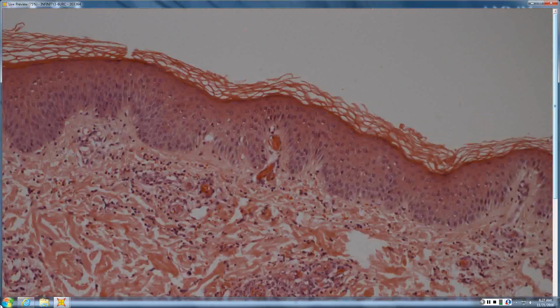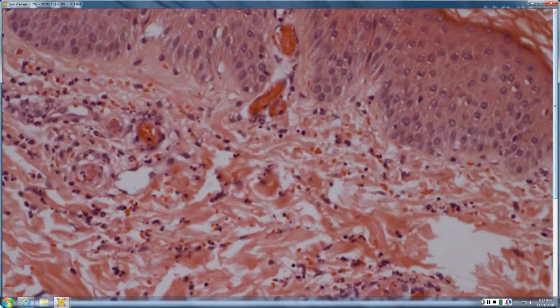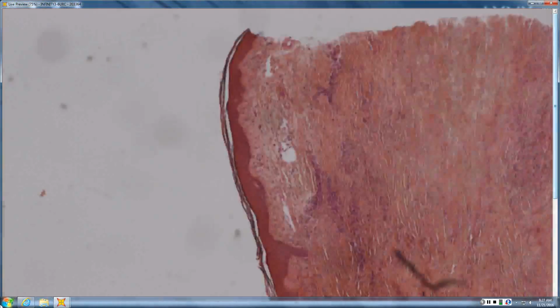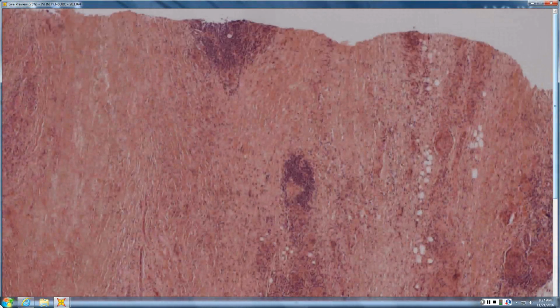So if you have thrombosis, expansion of the vessel wall, red cell extravasation because of vascular damage, neutrophils, karyorrhexis, probably LCV. The neutrophilic dermatoses like Sweet's and urticaria won't tend to have karyorrhexis. This looks great for NLD. So like a layer cake with the granulomas layered between the necrotic collagen, so that's necrobiosis lipoidica.